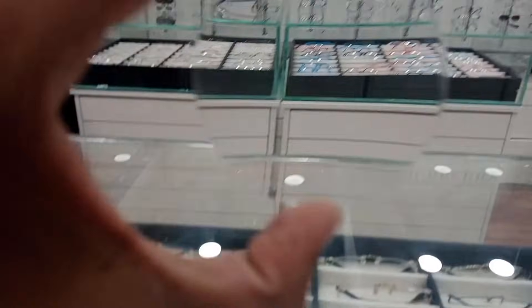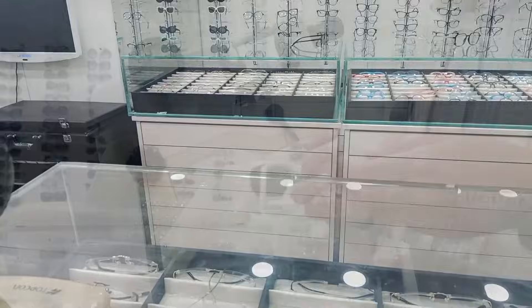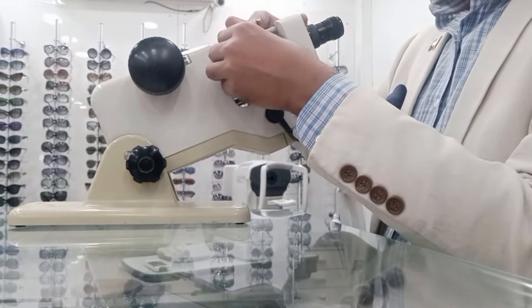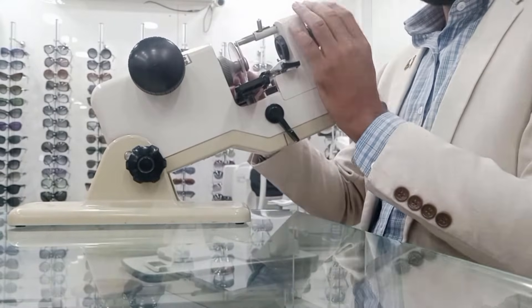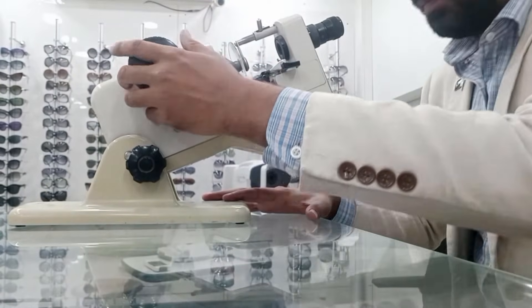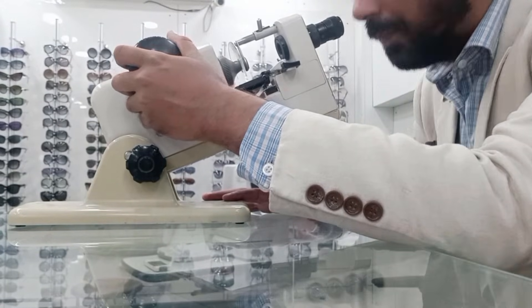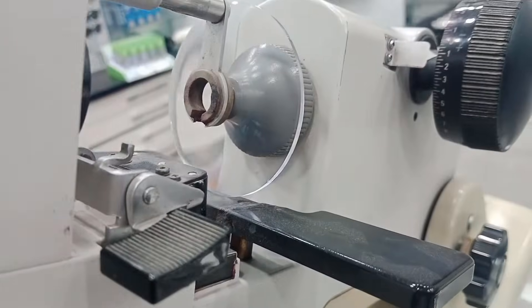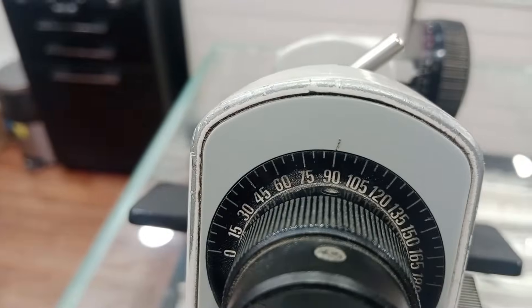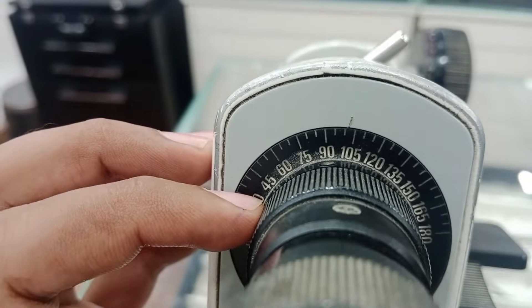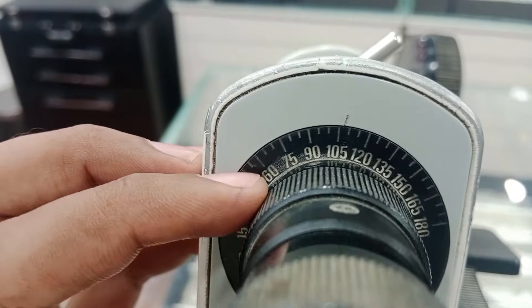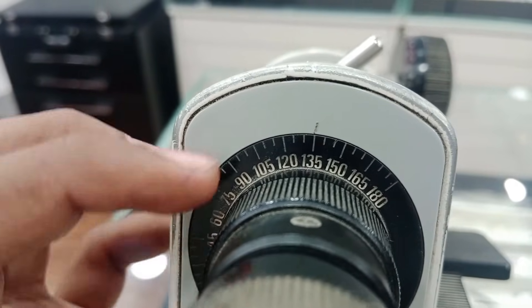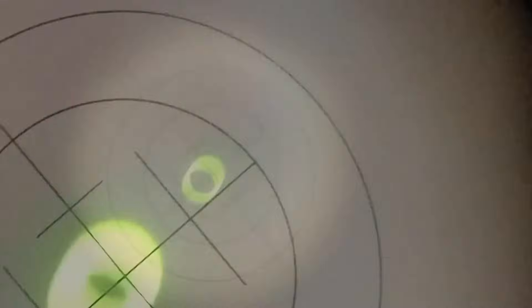And now we will learn how we can mark the axis on the lens. Let's put the lens again. First of all, the lens is there, and I have to maintain our desired axis. This is the axis dial. So my desired axis, let's see if I am going to take 135 axis.